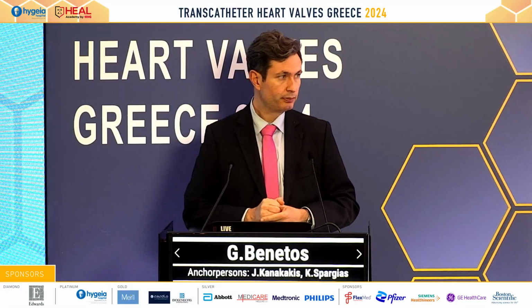Okay, Dr. Zanis. Yes, congratulations for the presentation. I would like also to ask, when we have compelling data from the echocardiography about the severity of the aortic stenosis, is CT pre-procedural planning accurate to guide what we're going to do if the aortic stenosis is severe? I mean, the CT calcium score or other parameters for the CT scan. Are these parameters accurate for decision making to do the procedure or not? I mean, if the aortic stenosis is severe or not.